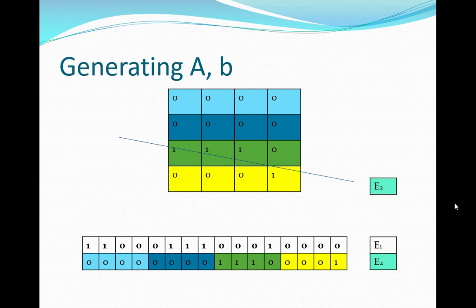Can you go over again what you were saying, like the last row being like the stopping power limit? Well, these ones right here, the energy. This is the A matrix. This is just a 2D example. So the proton that followed this path lost energy proportionally here.